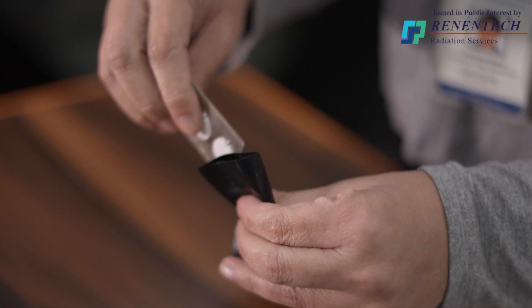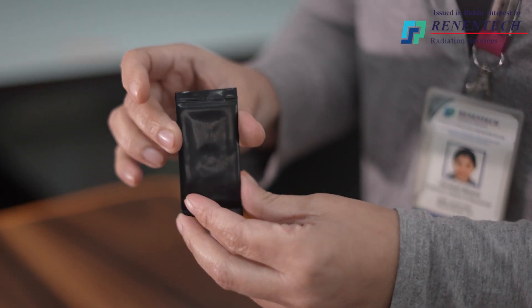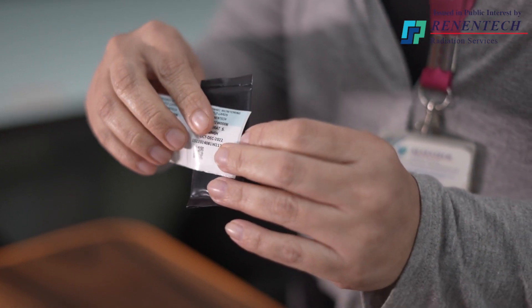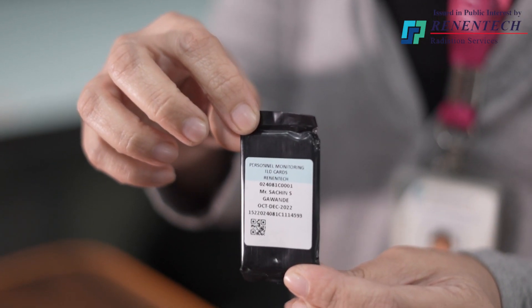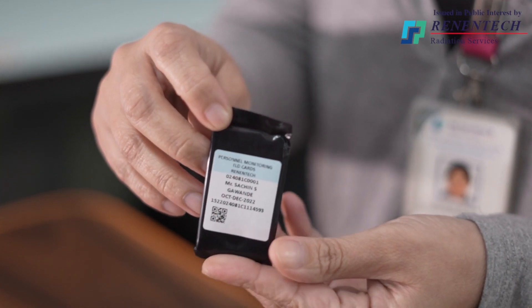None of these discs should be damaged. Then what we do — we just insert the disc cards into the black color pouch and it looks like this. On that we just stick a wrapper. The wrapper is basically a sticker which has the information about the person, person number and everything. The final TLD card looks like this, and in this form it will be sent to you.